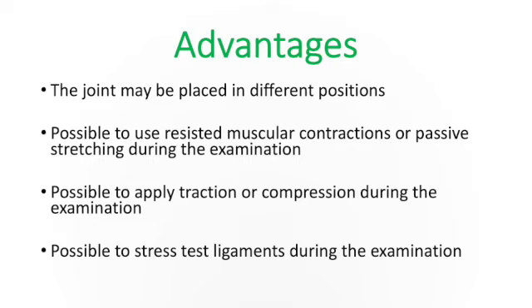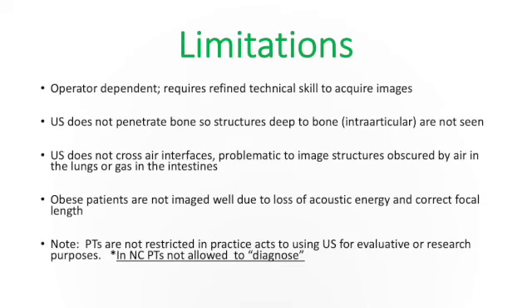Like every imaging modality, there's a lot of limitations. The big one is this takes a lot of skill. I'm going to tell you, I have practiced with the ultrasound machine that we purchased as a department for a long time. I would highly recommend practicing a lot before you actually start utilizing it in the clinic.